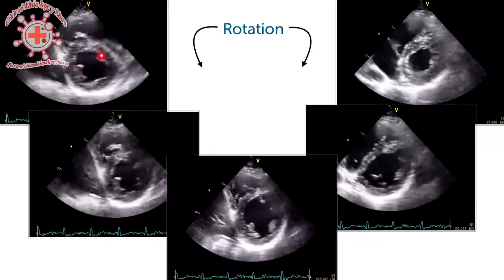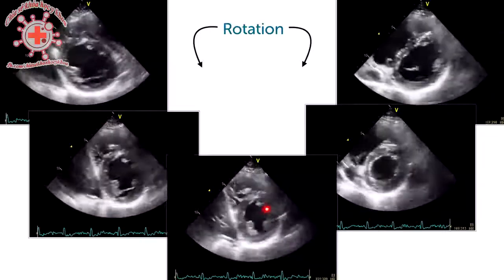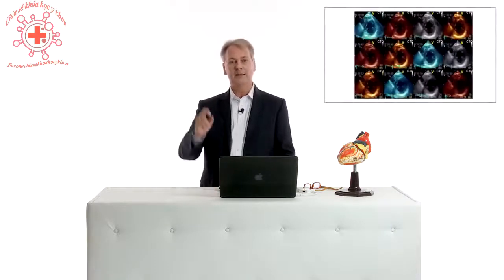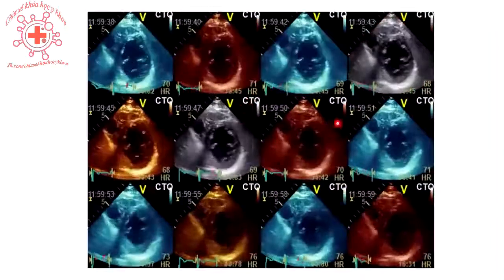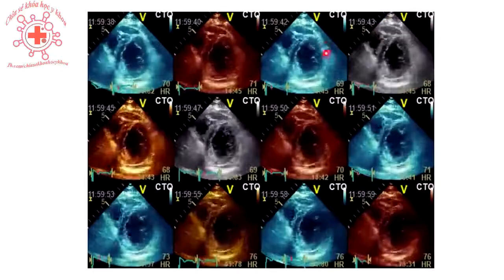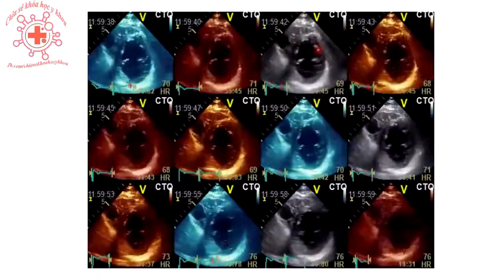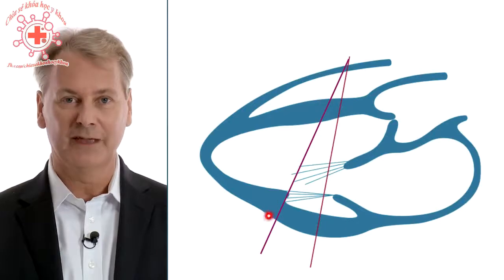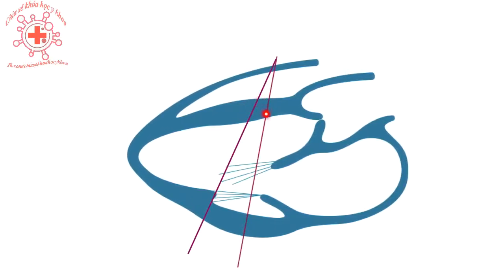When you start rotating back, you will eventually get to a view with a symmetrically round ventricle — this is the view you should try to achieve. If you use a transducer position that is too far caudal, you will also get an oval shape of the ventricle, but in this case the oval shape will be more in a longitudinal direction — like an Easter egg. To avoid that, simply move the transducer up one intercostal space. This demonstrates why we get an oval shape: we are cutting through the ventricle more obliquely, so one dimension will appear longer than if we cut perpendicular.